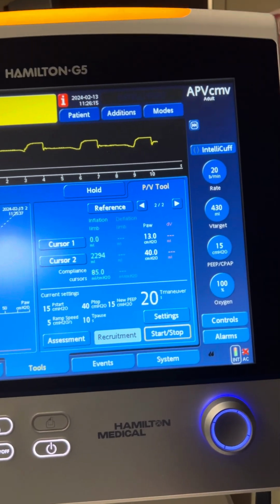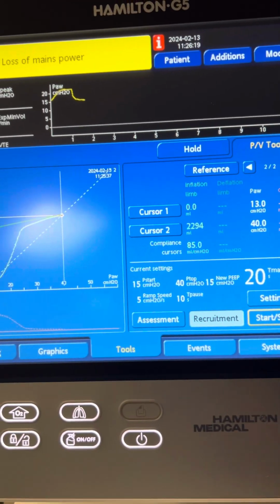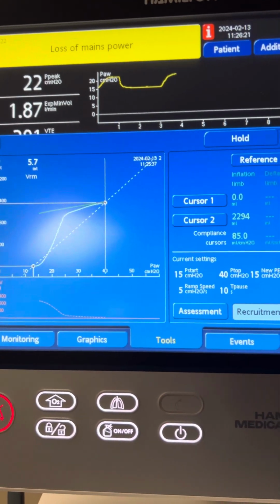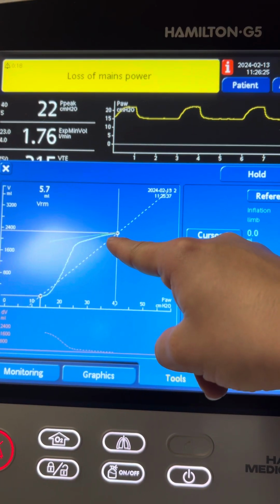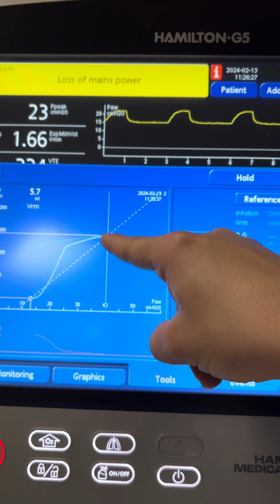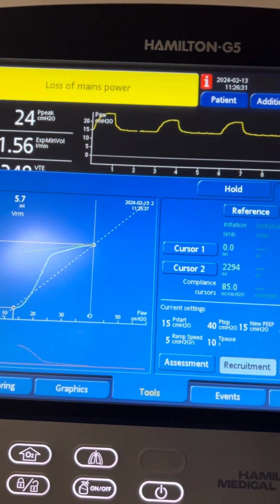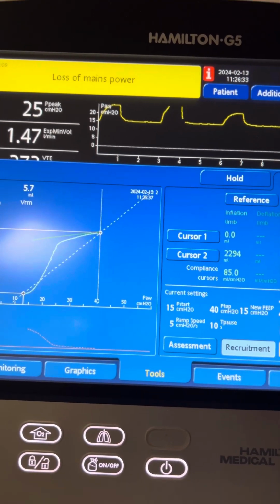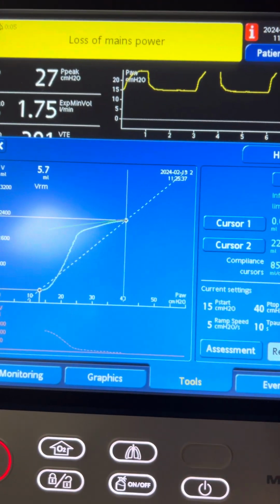And you notice your PEEP changed to 15 because you set your new PEEP setting to 15. What you would assess here, normally, is between the inflation and deflation limb on lungs that are more than just what my test lung is, which is technically just like one alveolus. You would see a change in volume between those two limbs.